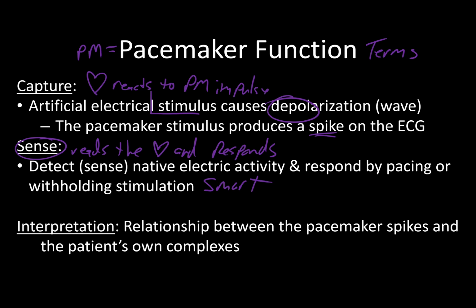Depending on the settings, the pacemaker is always looking at the heart, and if it sees that the patient creates a P wave or a QRS, then the pacemaker does not fire. It senses that and says, nope, I don't need to do anything.